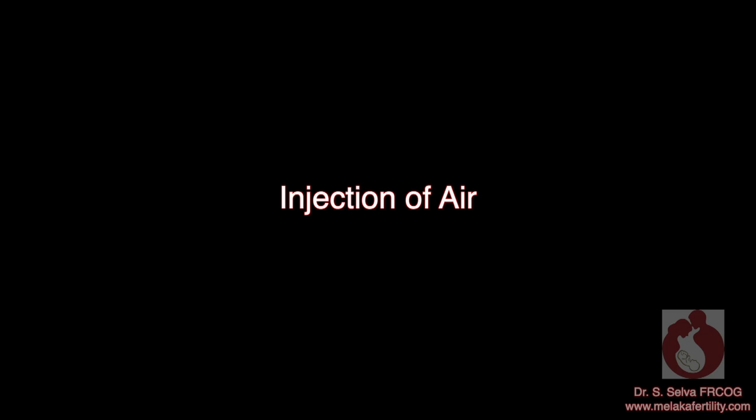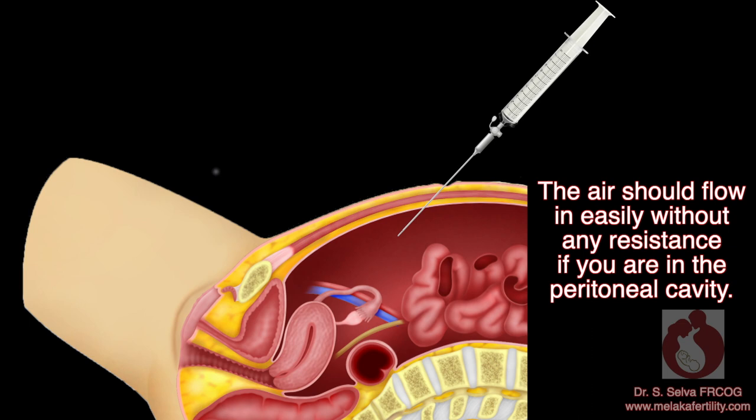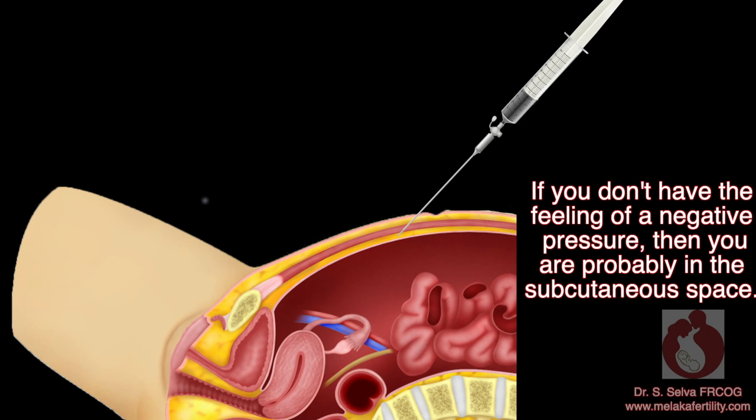Injection of air: I usually inject some air using the syringe into the Veress needle. The air should flow in easily without any resistance if you are in the peritoneal cavity. I will then aspirate. If you still have a negative pressure, then you are in the peritoneal cavity. If you don't have the feeling of negative pressure, then you are probably in the subcutaneous space.